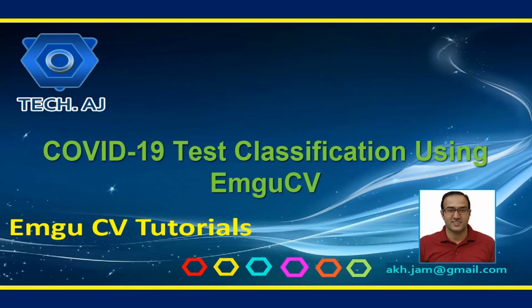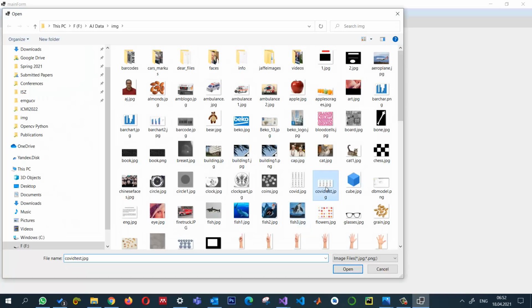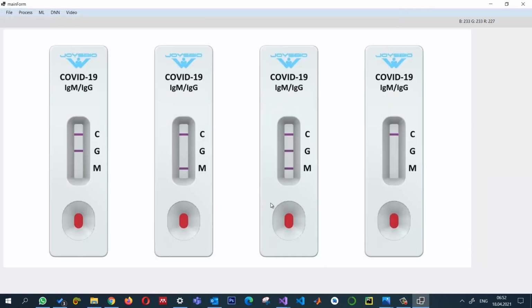Hello and welcome to this new tutorial, and in this tutorial we will learn how to do COVID-19 test classification using Emgu CV. Here is the demo of the application. We will open an image. Let's say this is the COVID-19 image, and when we click on COVID test, it will show that this is positive, this is positive, this is positive, and this is the negative.